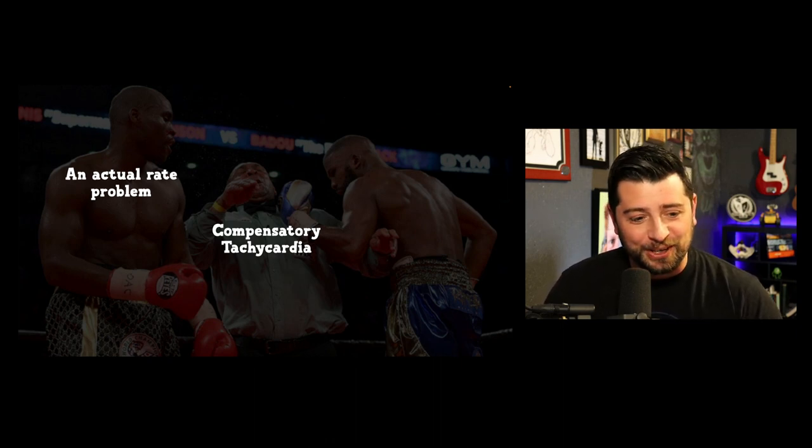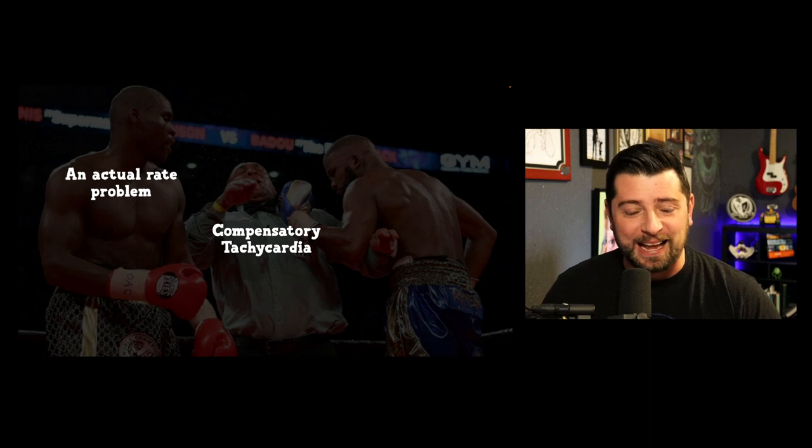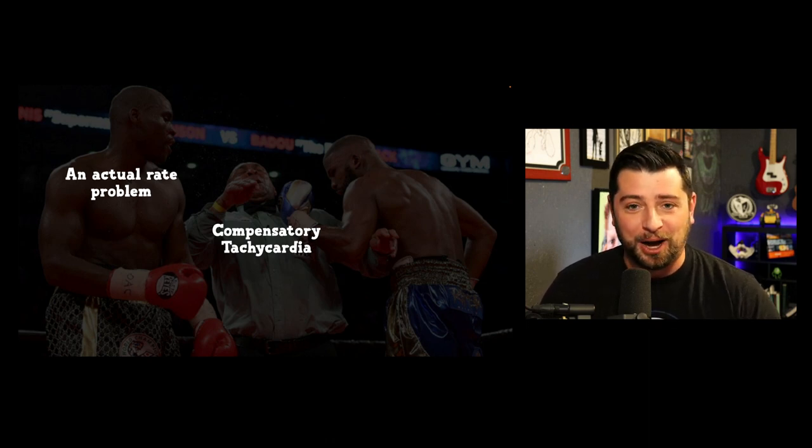You can see here — I got the actual rate problem. But this isn't it. I'm actually just knocking out the compensation.